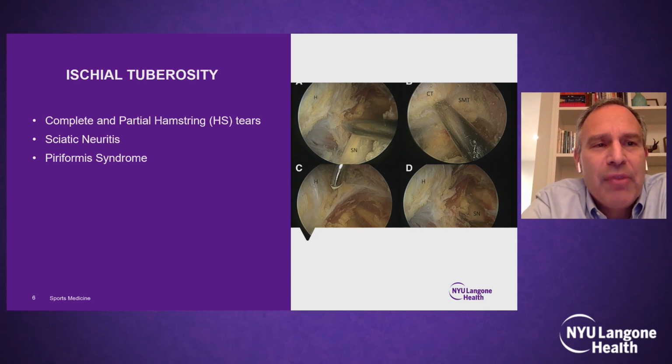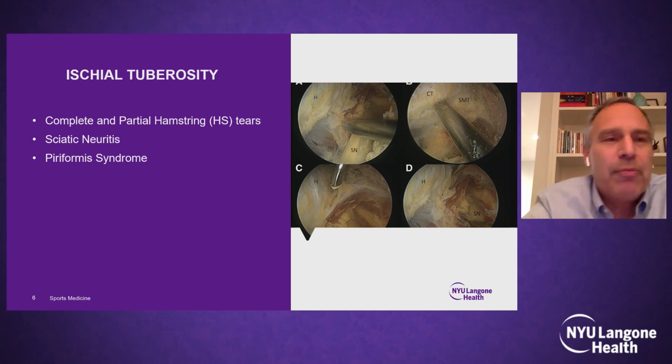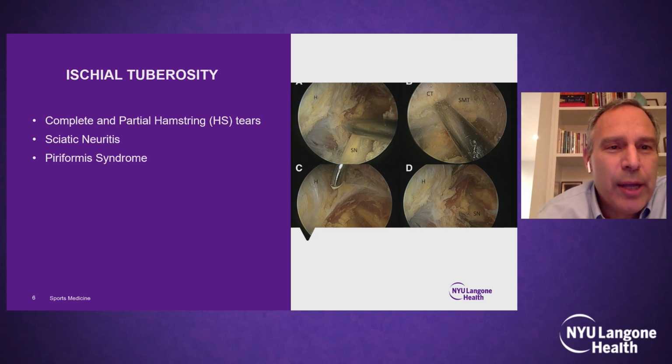Again, you have to work on this fairly quickly and just be mindful that there's a whole reach of vessels that could be potentially injured, and it can turn quickly into a bloodbath. So at this point, while I consider myself a pretty decent arthroscopist, for me, piriformis syndrome, I'm still doing open and currently have no plans of pursuing this endoscopically.